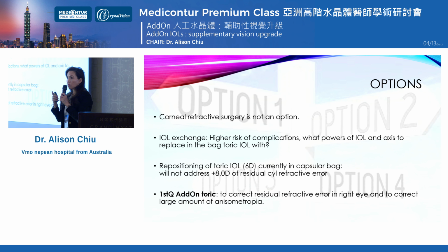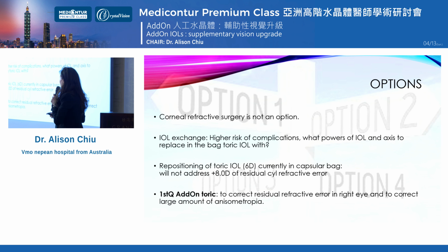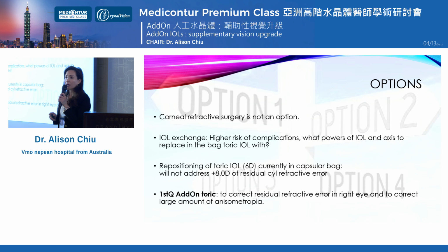Repositioning of the toric IOL, I've got no idea. Mathematically, I'm not clever enough to figure out if rotating that IOL when I don't know the original implant axis is going to do the job. Plus that carries higher risk because you've got to free the lens up to rotate it.